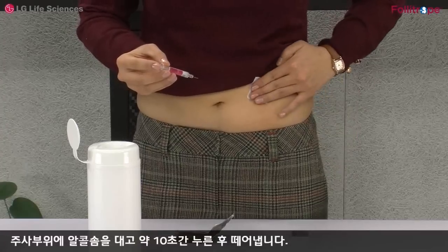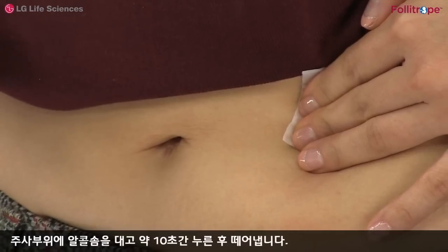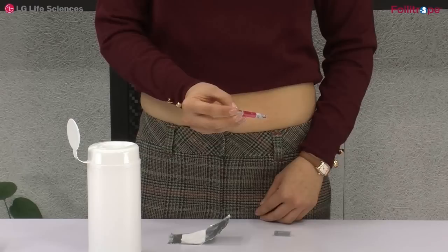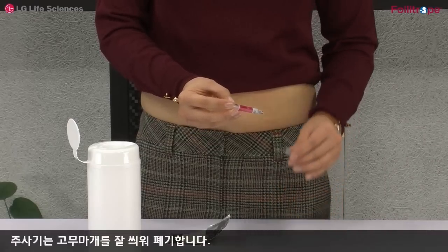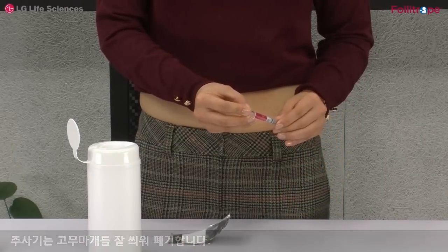주사 부위에 알코올 솜을 대고 약 10초간 누른 후 떼어냅니다. 주사기는 고무마개를 잘 씌워 폐기합니다.